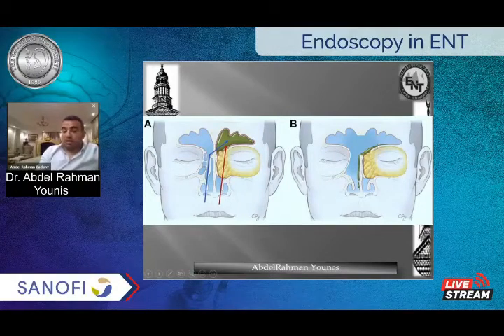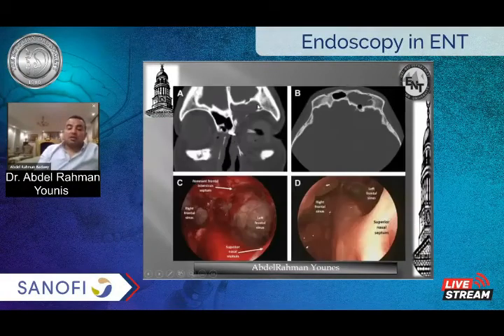So the contralateral approach is either from the contralateral nasal side or from the contralateral sinus to go far lateral in the frontal sinus.